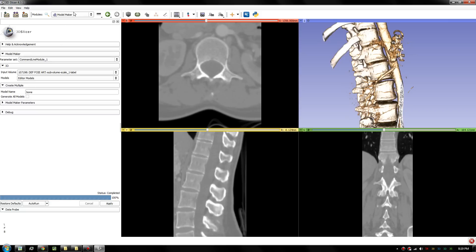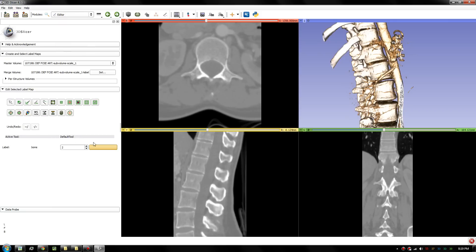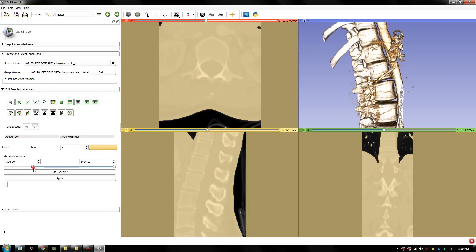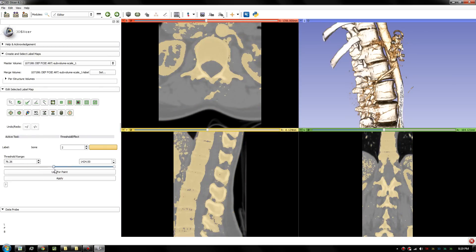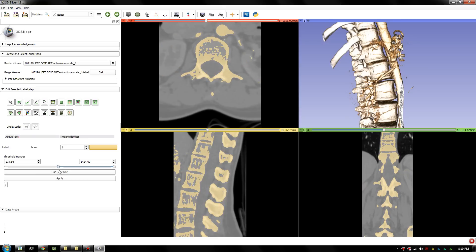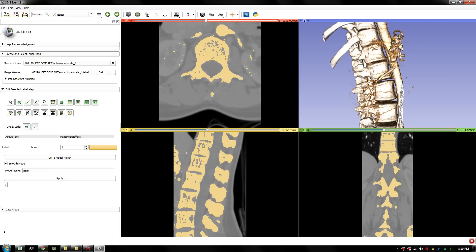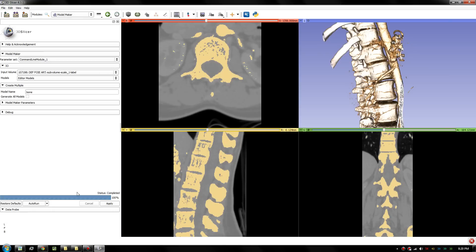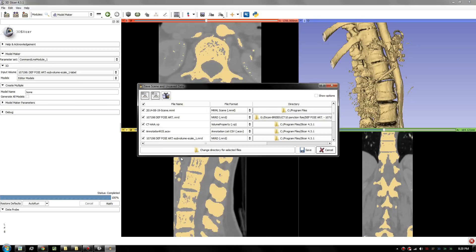Let's go back to the editor. We apply the selection and let's try that again. I think we just need to click apply. Select that, click apply and generate model. Give it a name, apply, start generating model. Go to model maker to see the progress. Just click apply again to see that's been done.